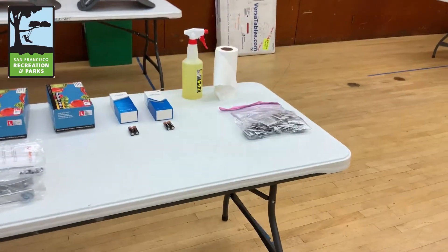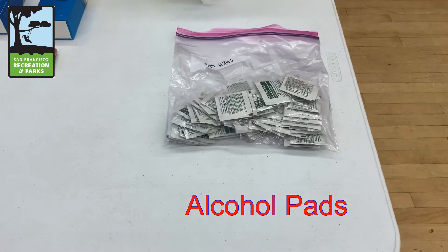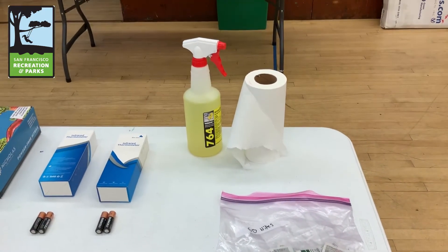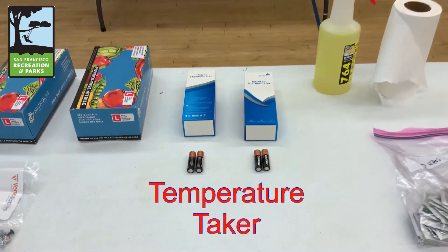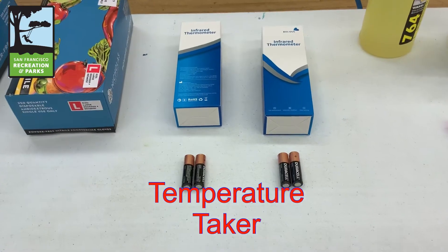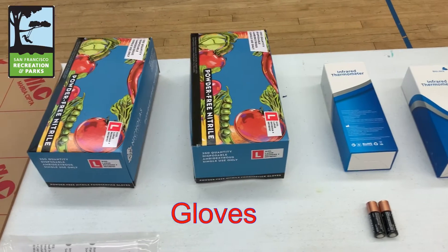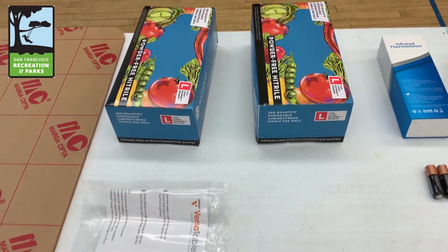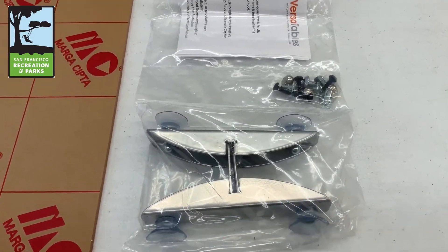Things you will need for your check-in table: alcohol pads, disinfectant and paper towels, your temperature taker with batteries, gloves, parts for your plexiglass shield, and of course your plexiglass.